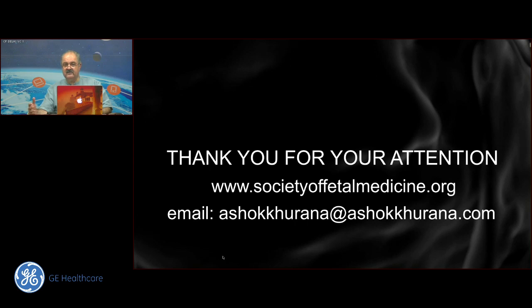When I look at kidneys that have a strange echogenicity, I will again definitely make sure that this is well looked after. If I look at a simple classical multicystic dysplastic kidney, I might ignore it. If I find what I'm mistaking for a bilateral multicystic dysplastic kidney and I want to know what future pregnancies are like, I will definitely like to do a genetic evaluation. Echogenic kidneys, always a genetic evaluation to exclude the trisomies, and a CMV evaluation at the same time, and then of course a detailed clinical history, a pedigree, a complete genetic evaluation.